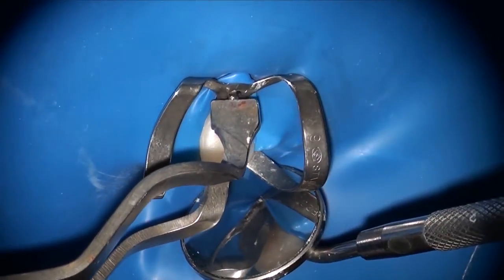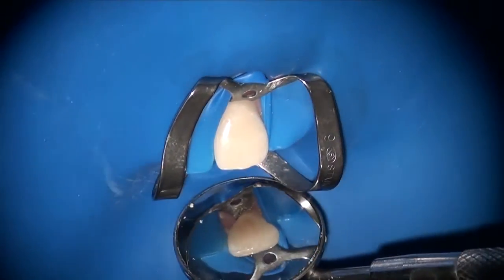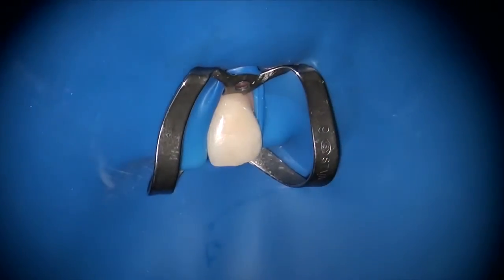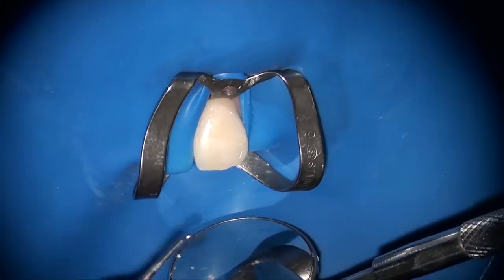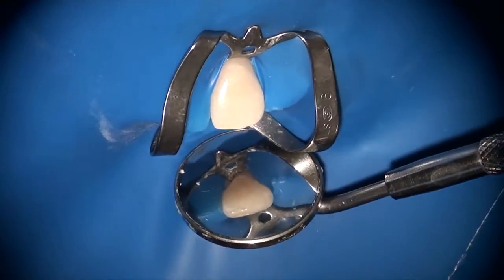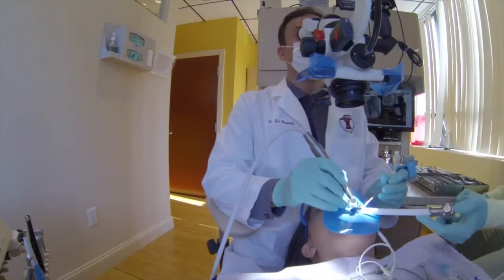I use the Handy Dam rubber dam, which is a fairly easy one to apply because of the fact that it includes the frame inside it. I'm using a number nine clamp. I clamp on this tooth and then after inversion, I start the access opening.